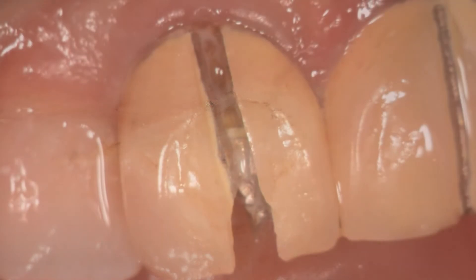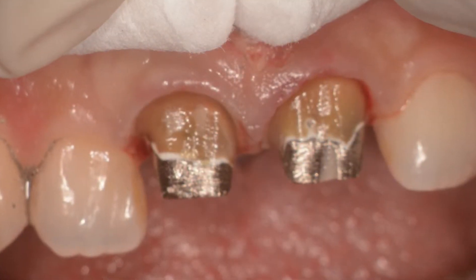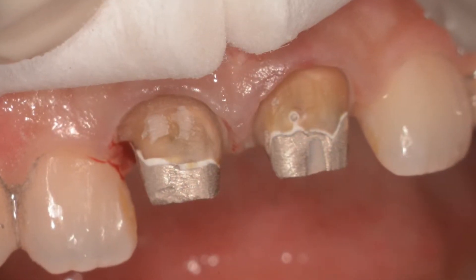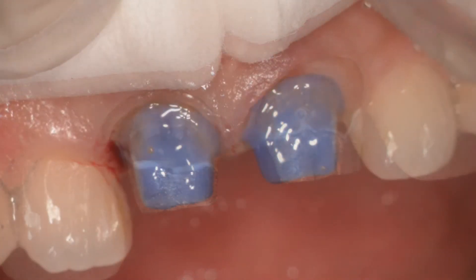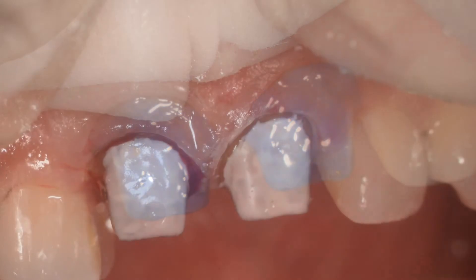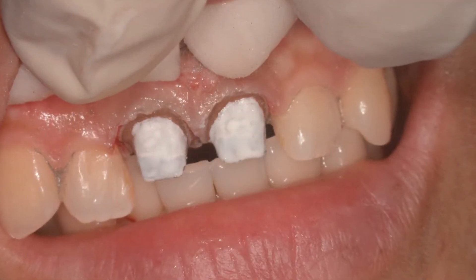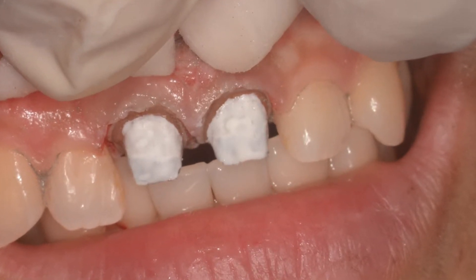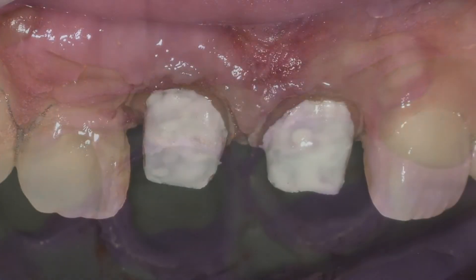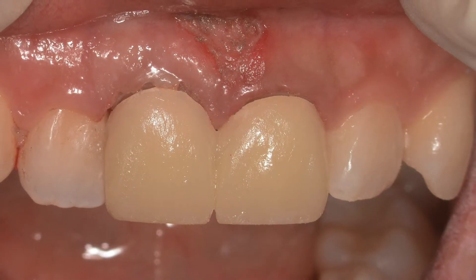We now remove the old crowns by cutting through them, revealing two cast posts and cores underneath. These were air-abraded and then a solution of block-out material was placed over after etching and bonding. This opaquer that you see here allows the teeth to be blocked out, and then we use a diode laser at 0.8 watts to trough. Here you can see the impression of the two crowns, the tissue immediately after troughing, and the frenectomy.